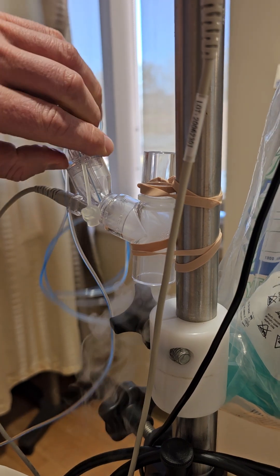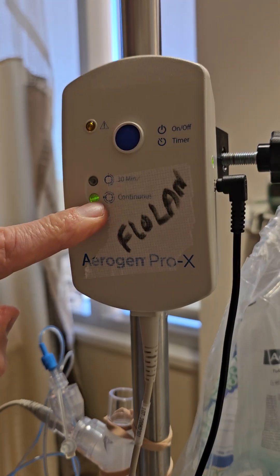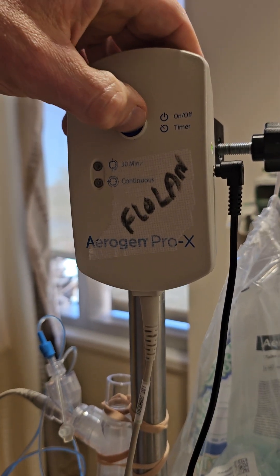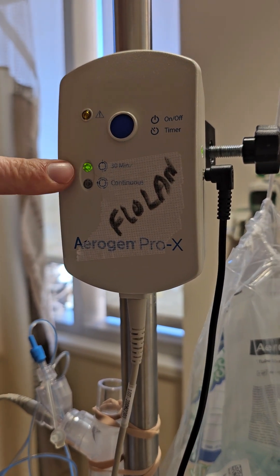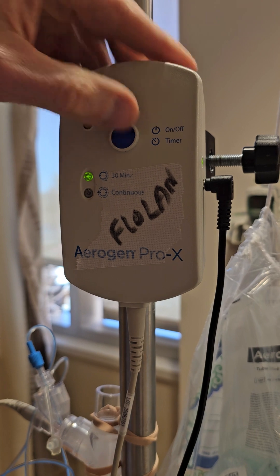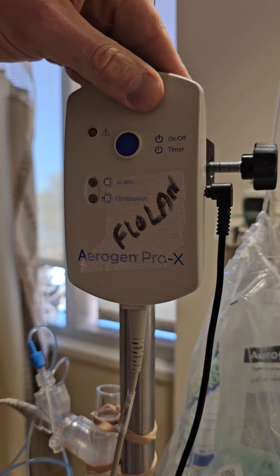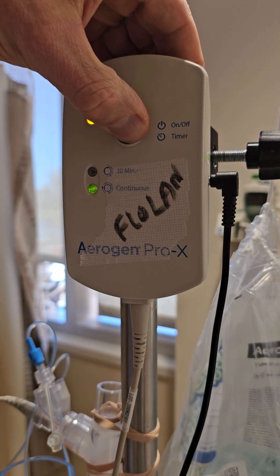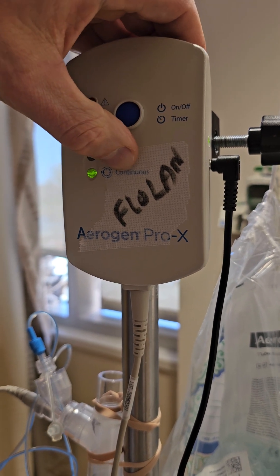The Aerogen nebulizer should be on continuous mode. If it's not — when you normally turn it on, it just goes to the 30-minute mode, which we obviously don't want. To change it, just long press the start button and it'll flip down to continuous right there. That's how we want it.